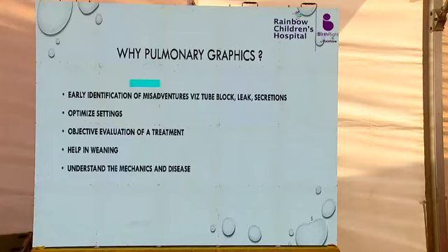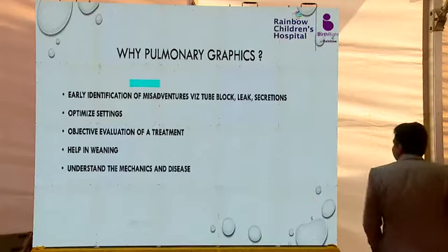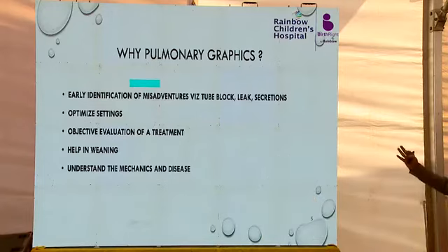Okay, so why pulmonary graphics? I think from here it is easier. Sorry. So why pulmonary graphics? Your purpose of putting the baby on ventilator is gentler ventilation. So you can optimize ventilation depending on the graphics.